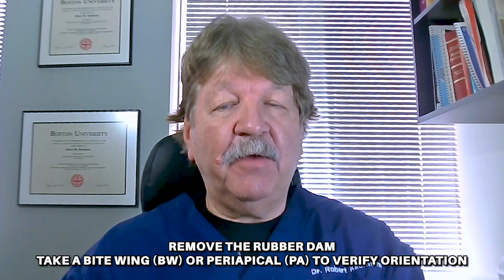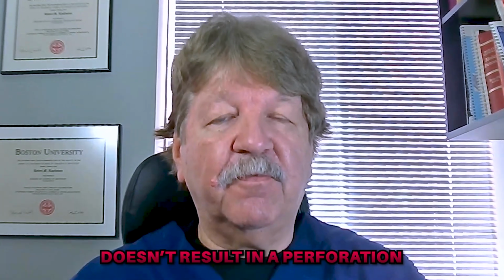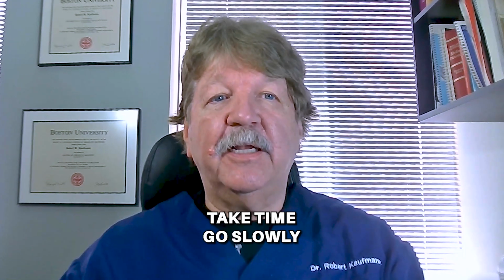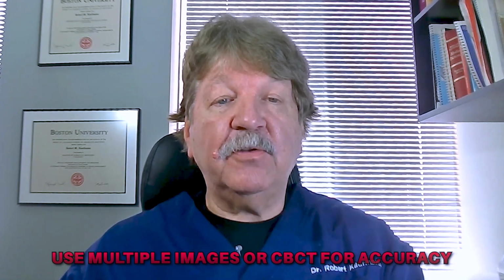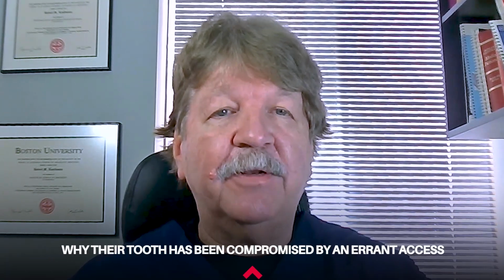When you're accessing through crowns and may be unsure of the direction that you're going, it's helpful to remove the rubber dam and take a bitewing or PA to confirm the direction of your access doesn't result in perforation. It's far better to take your time, go slowly, and check the orientation often with multiple images or a CBCT than to have to explain to the patient why their tooth has been compromised by an errant access.